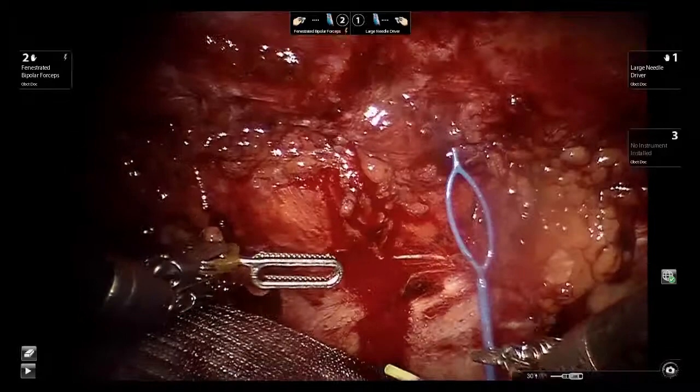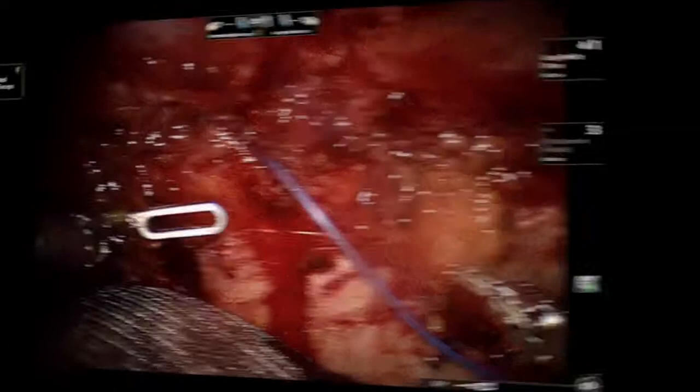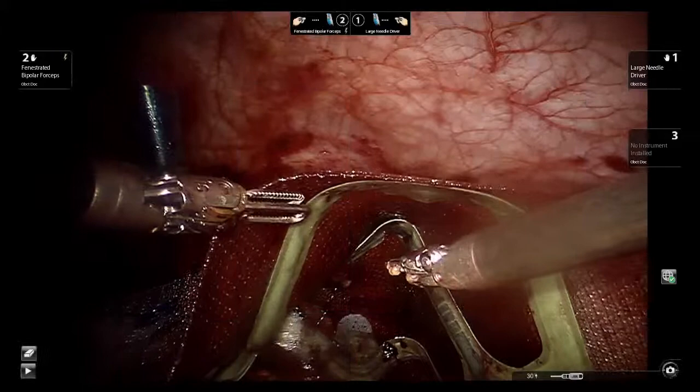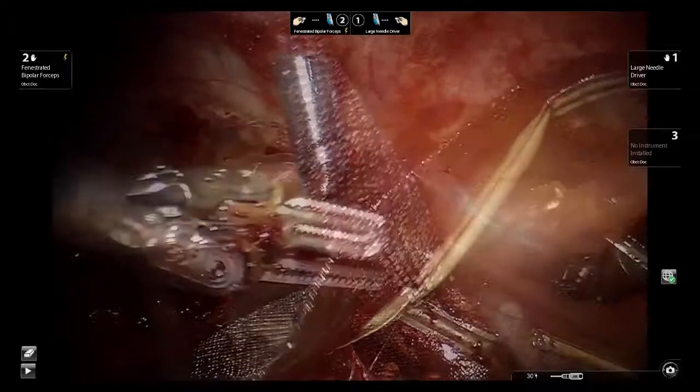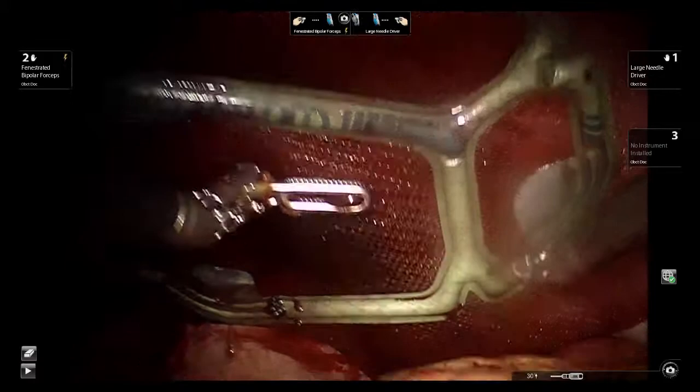Using a fascial retrieval device, the small loop on the mesh is brought out through the mid portion of the hernia defect. This will allow us to bring the mesh up to the anterior abdominal wall. One of the benefits of this particular mesh is that the green component is like a balloon that you fill with air and it ultimately expands, thus allowing for the mesh to be held in place against the anterior abdominal wall without the need to utilize an additional robotic arm to hold the mesh up to the anterior abdominal wall.